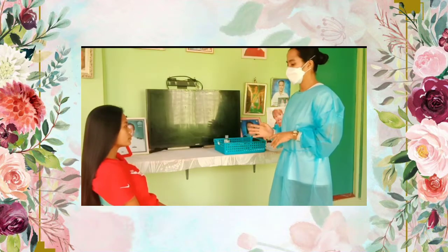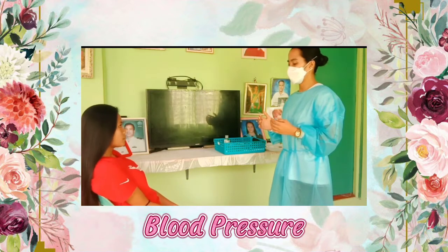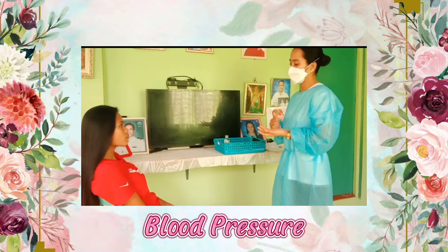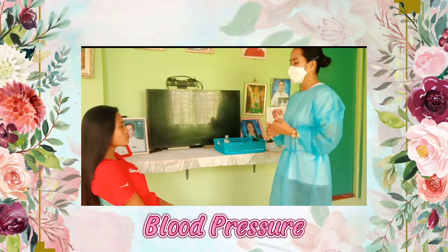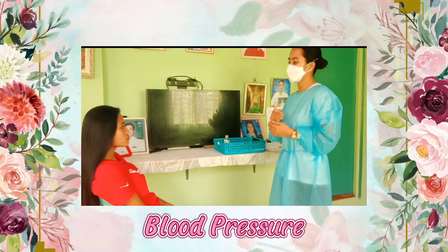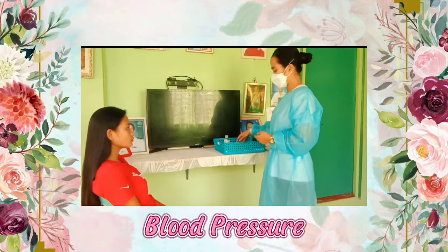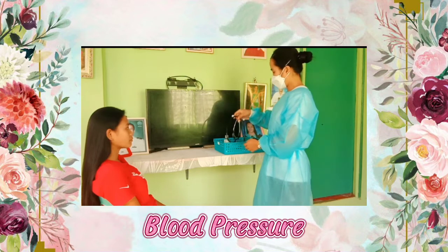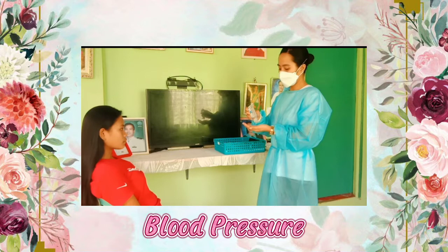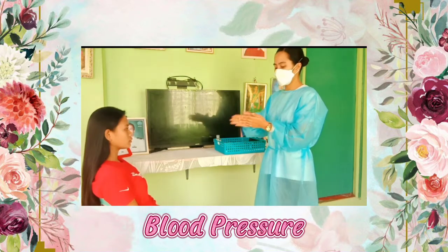Now, ma'am, we're going to assess your blood pressure. Blood pressure is a good indicator of cardiovascular health. It reflects the interrelationship of cardiac output, peripheral vascular resistance, blood volume, blood viscosity, and artery elasticity. The equipment needed in assessing blood pressure are stethoscope and sphygmomanometer. But first, we need to perform hand hygiene to prevent transmission of microorganisms.